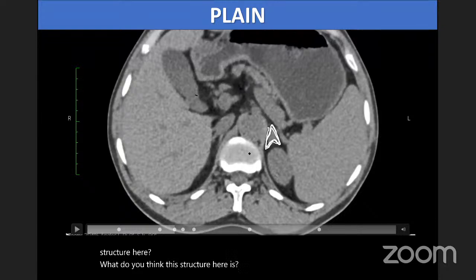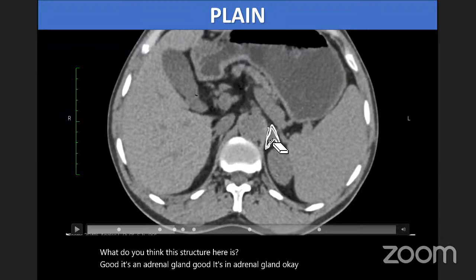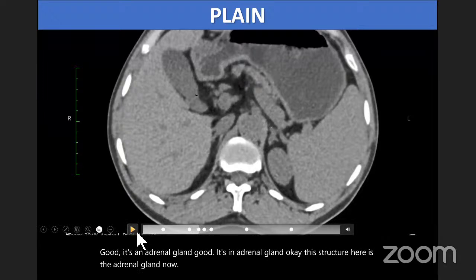Good, it's an adrenal gland. Okay, so this structure here is the adrenal gland. Now just observe from here, just keep watching.